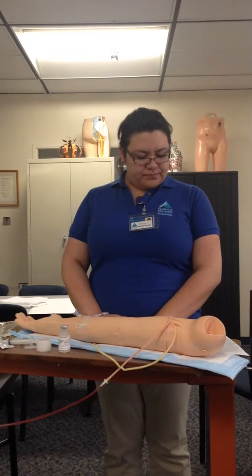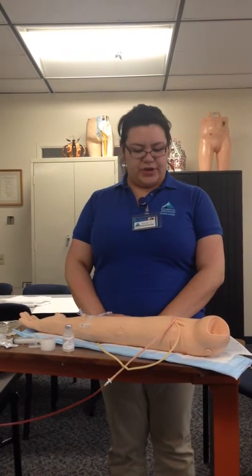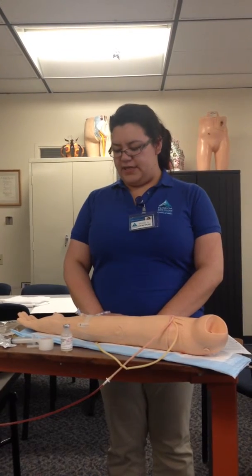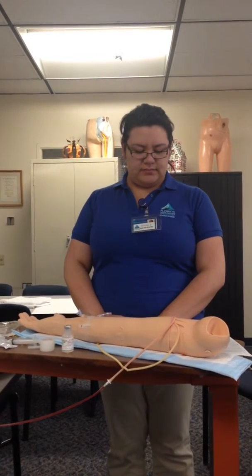My name is Brooke from Section 2, and today I will be demonstrating administration of an IV med via the minibag. So first I would check my physician's orders and verify the correct medicine, dose, route, frequency of the med, assess the patient's lab values and history of allergies.